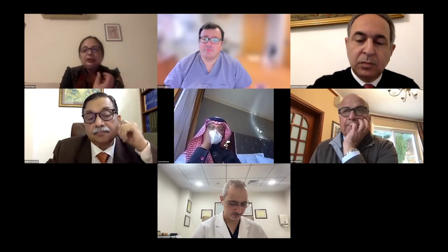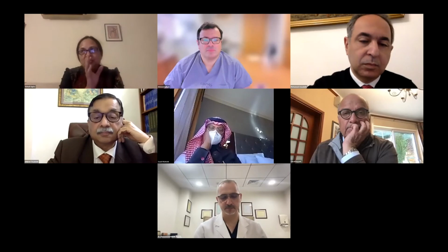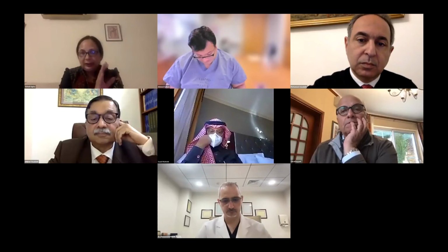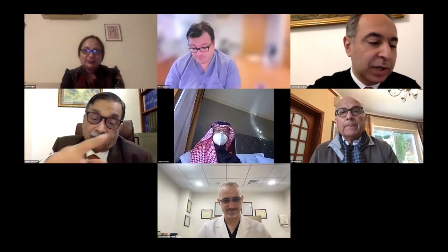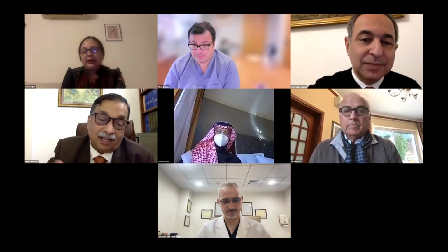The second part is if the retina is very stiff and I feel I have to do a retinectomy, then a complete retinectomy will be done. If I tell you genuinely, in this patient, when I started, I did not have a plan to do retinectomy. I thought I would be able to support this angioma. But the retina was short and contracted, so I had to change the plan. It's a little scary because sometimes it can be an extensive retinectomy, and then you're worried whether that fold will settle back or not. You were lucky, it settled well.